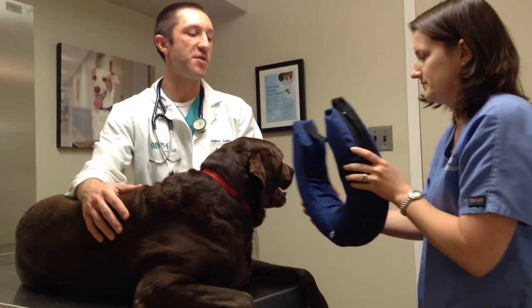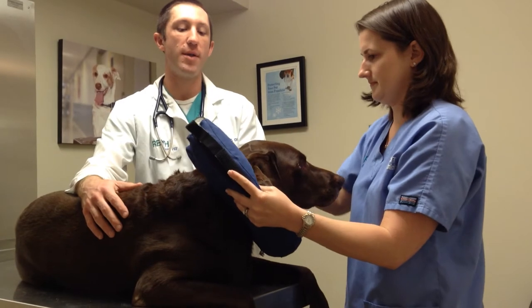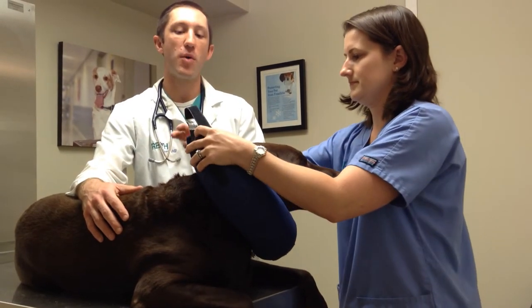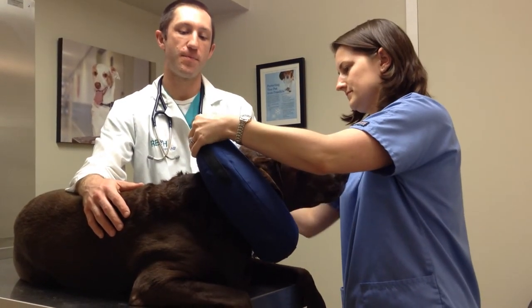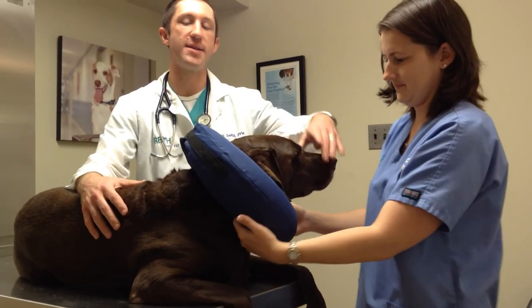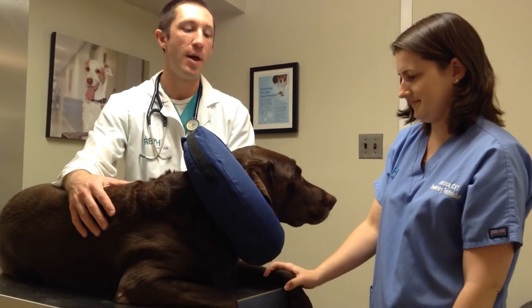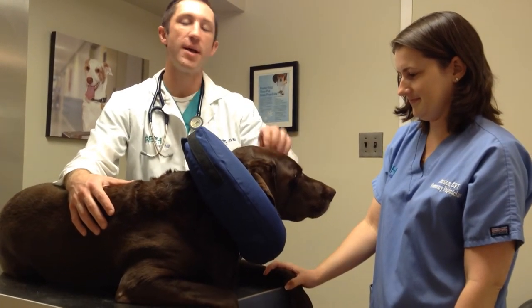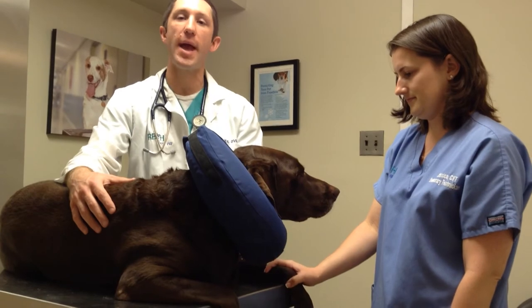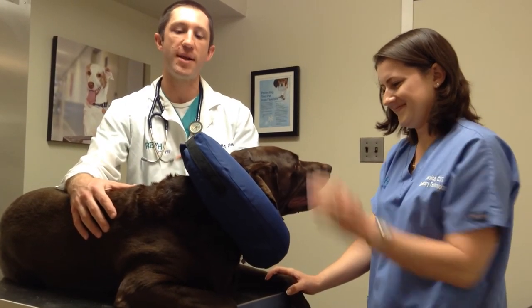This one is one you can find at most pet stores. It's an inflatable donut, and it simply just goes around their neck and velcros into place. It's important to note that it's designed to prevent their neck from moving to be able to get to parts of their body, but you can see Sedona's ears and her eyes are still free game. If she had a problem there, she could still get to them. So that is the one disadvantage of this type.